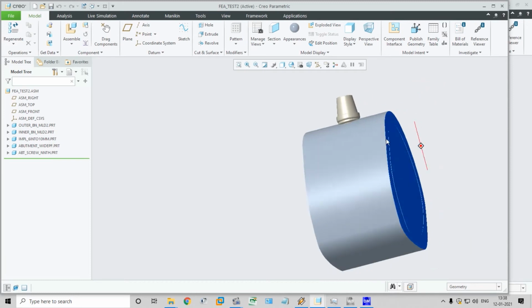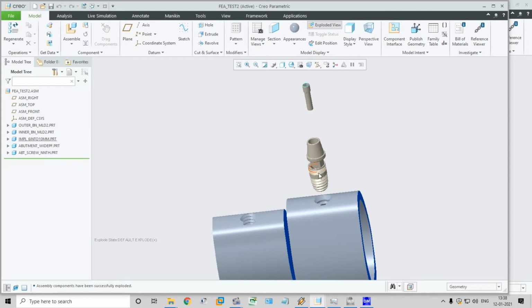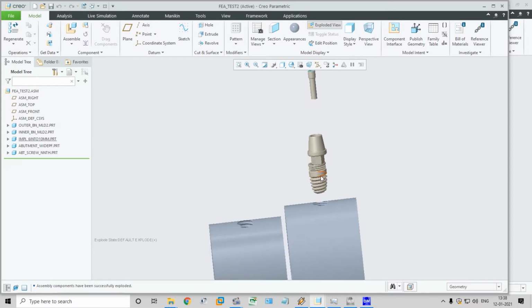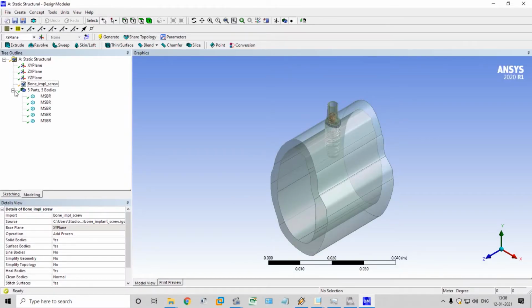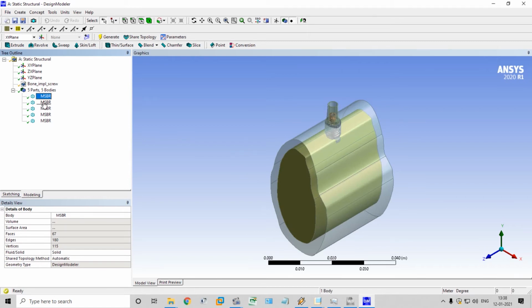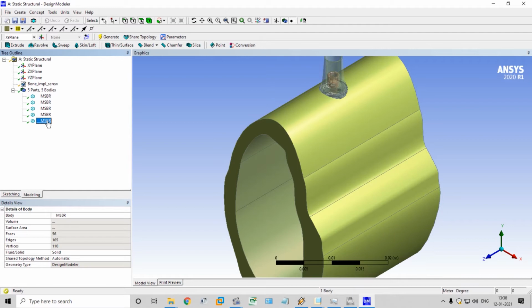It's another model. 6 into 10 mm implant, abutment wide platform, screw, cortical bone, cancellous bone. I think it has got imported, right? Cancellous bone, implant, abutment, screw and cortical bone. You should rename this, okay?